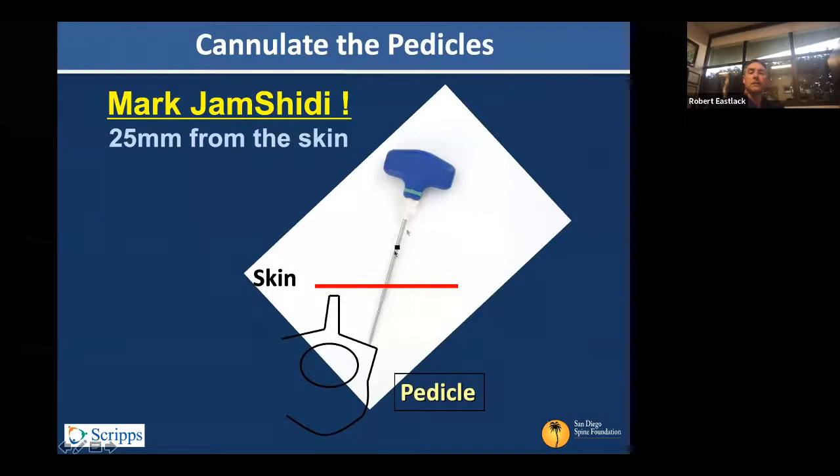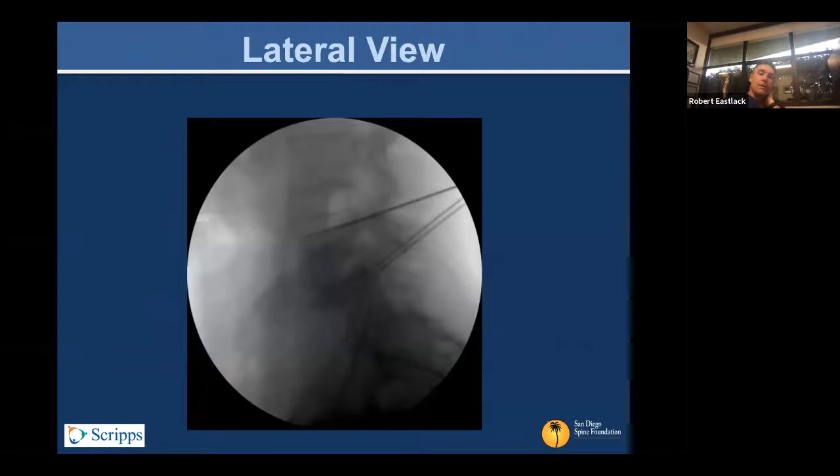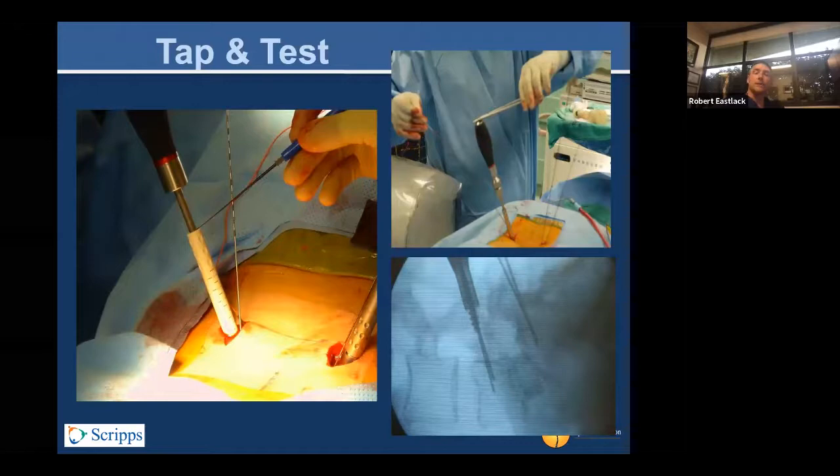Here's the concept of one of the old Medtronic Jamshidi needles that didn't have gauging — here's the skin level, and you mark thirty millimeters or twenty-five millimeters above it. When that mark gets to the skin, you know you're buried to that point. The en face or pedicle view, as we call it in the OR, is looking straight down the chute of the pedicle. It's a nice way to be sure you're really centered and have not violated the pedicle, nor are you too lateral. Here's a look at the lateral view with the guide wires in position. You can also neurostimulate the tap if you wish, but you need a sheath for it — it won't work to stimulate unprotected metal.